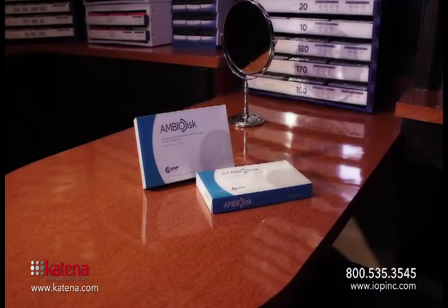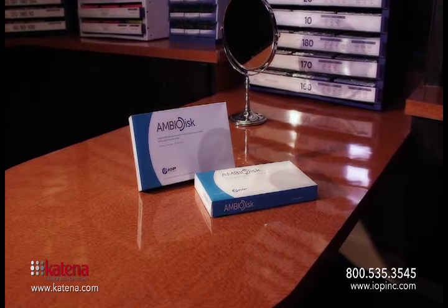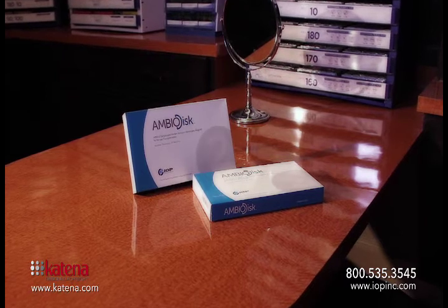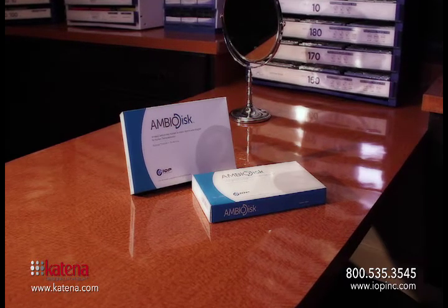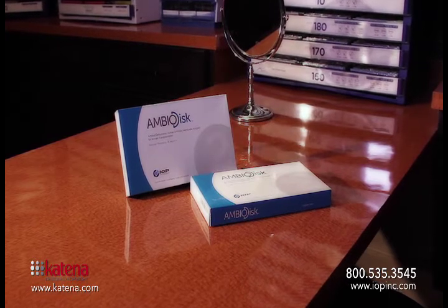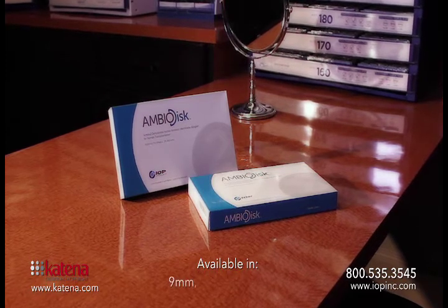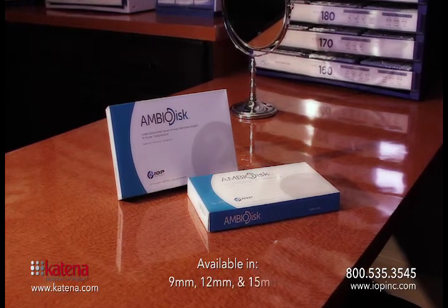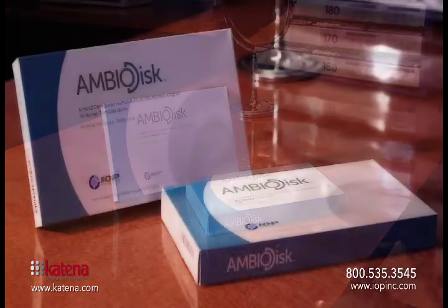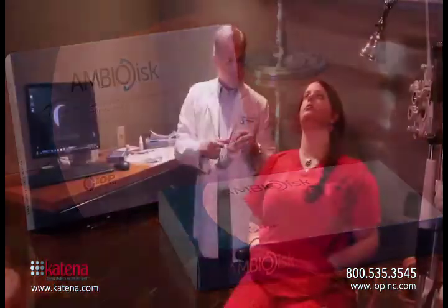Here you can see the packaging for the AmbioDisc. They're really small and they don't take up a lot of space. One of the benefits of the dry amniotic tissue is that it does not have to be refrigerated, so you can actually keep it in an exam room ready to go. You don't have to worry about taking it out of a freezer. The disc is available in three different sizes: a 9mm, a 12mm, and a 15mm. The 9 and 12mm are more commonly used in optometry offices just because they can easily be put on a stock contact lens.